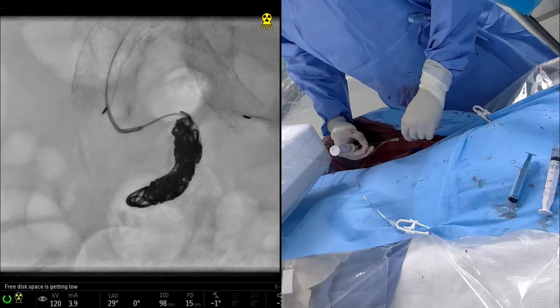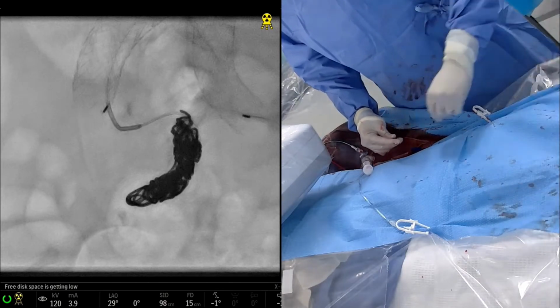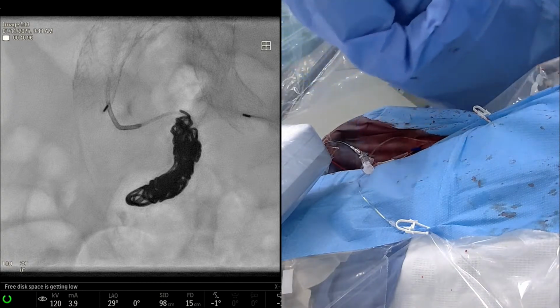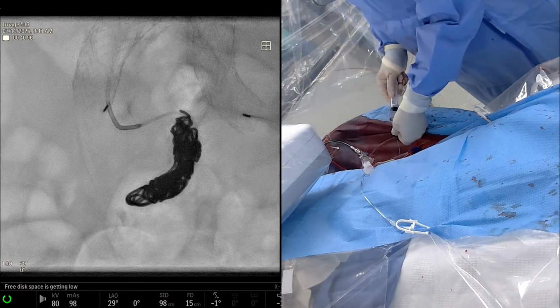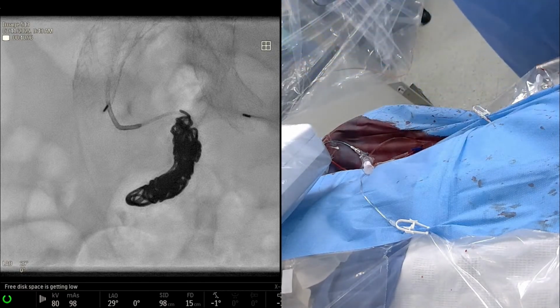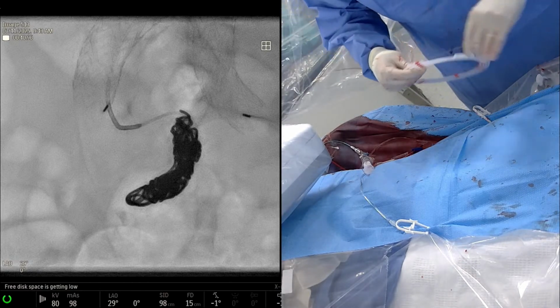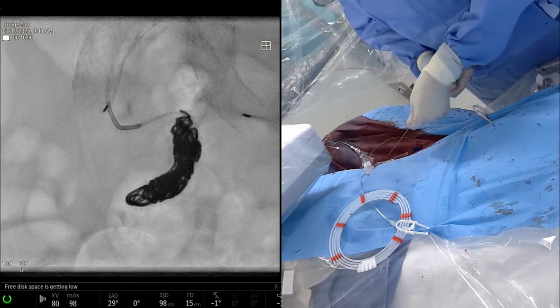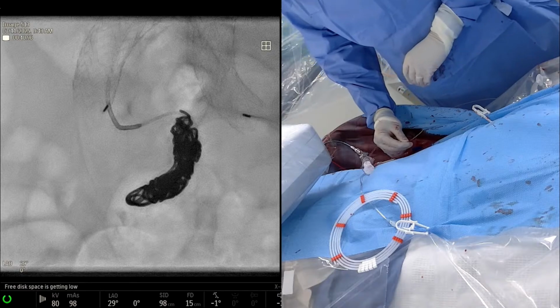So you can see there, we've kind of buried the microcatheter. Now it's just going back out. The one thing I do like about the Lantern or the 2.8 ProGrate 150 is that it has the dual marker, so I don't have to see the tip of the microcatheter to know how far in. Exactly. So here we're going to take the smaller packing coil, the Penumbra 60 packing coil, and sort of the same idea. Go ahead. We'll just load this up.